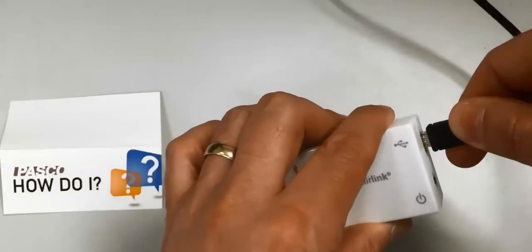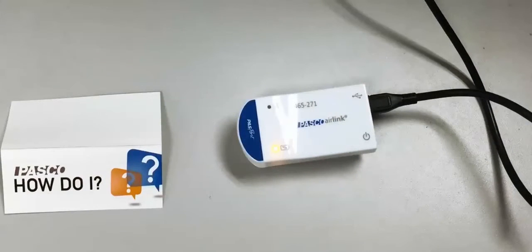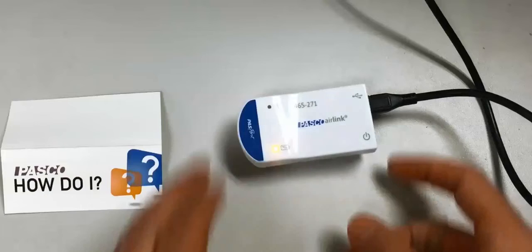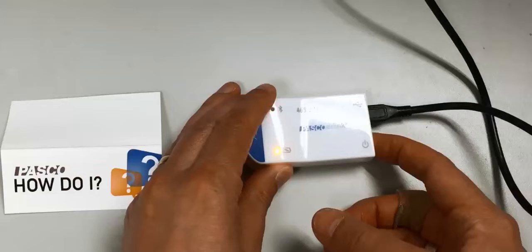Once that's firmly attached to the unit, grasp the air link on the far side from the power connector, and then press and hold the power button for 10 seconds. A normally working air link will have the charging light on the lower left hand side lid.